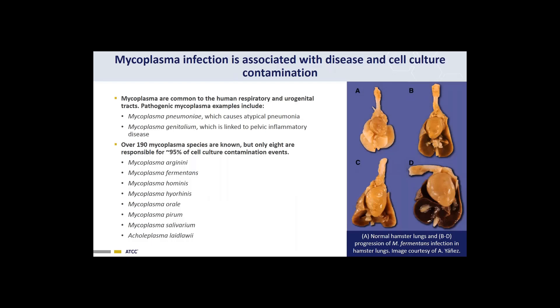Mycoplasma infection not only affects cell cultures, but is also associated with human and animal disease. In humans, mycoplasmas are common in the respiratory and urogenital tracts and cause diseases like pneumonia and pelvic inflammatory disease. Mycoplasmas can also infect animals, as the photo on the right depicts an infected hamster lung — note the gross anatomy of a healthy lung in photo A compared to photos B through D, which show the progression of mycoplasma infection. There are over 190 known mycoplasma species, but only eight are responsible for about 95% of all cell culture contaminations.